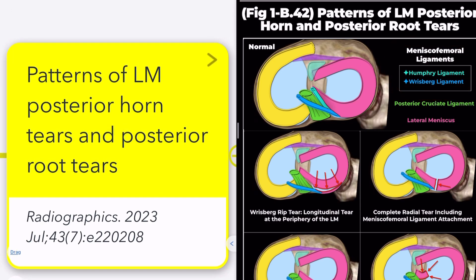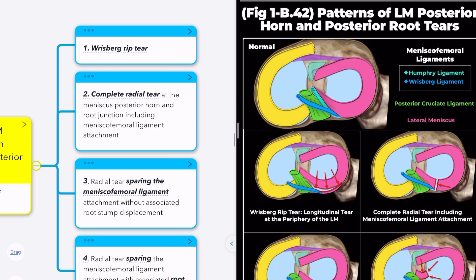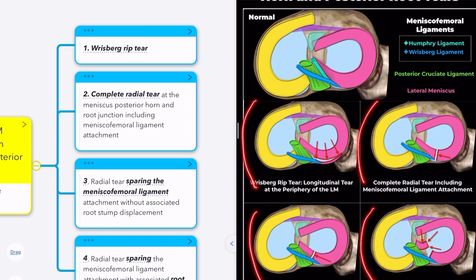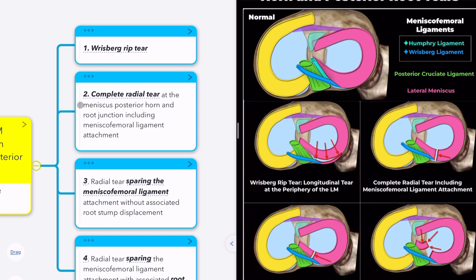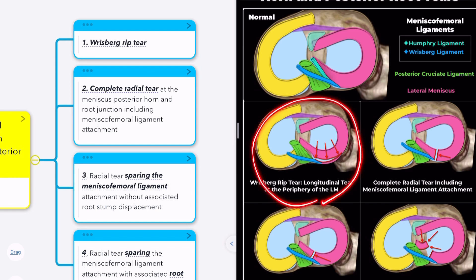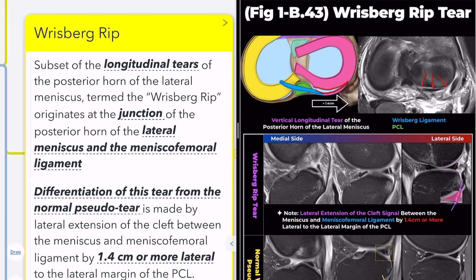According to Radiographics in 2023, patterns of lateral meniscus posterior horn and posterior root tears were classified into four categories considering the meniscofemoral ligament. Today, let's focus on one of these categories: the Risberg rip tear.